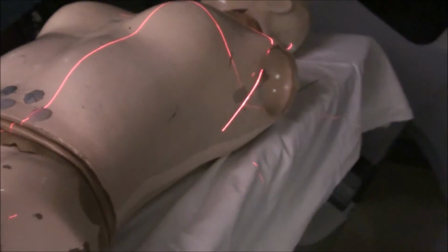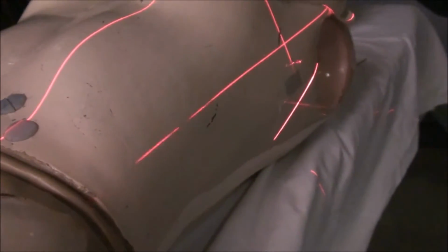So what we're going to do is we're actually going to rotate a hair and raise the patient a hair. Now, back pointer laser, CR. We've got our entry and exit points, there and there.